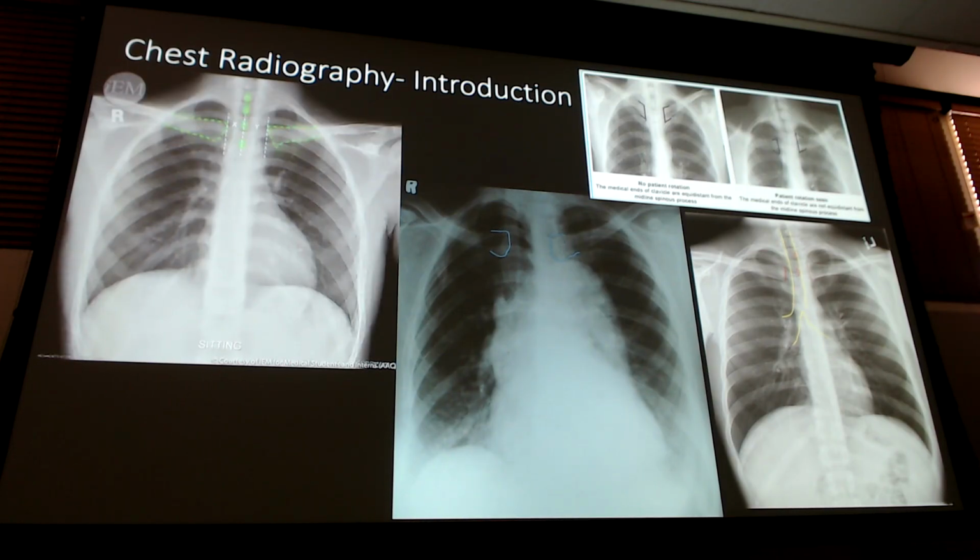But I'm telling you, dislocating your sternoclavicular joint like right in here is so difficult to do. Right? So difficult that we don't even have it as an abnormality. So if you see this, it's rotated. Okay? I have this nice little animation here of another one, showing you as it rolls through, tracing out the trachea, the carina, the spinous processes, and the edges of the clavicles.